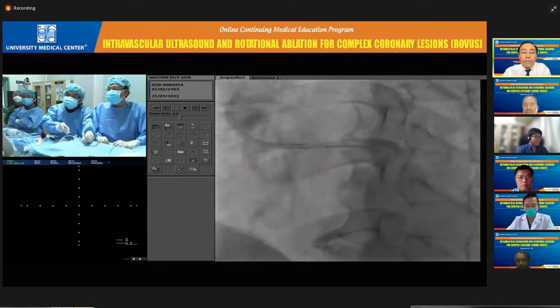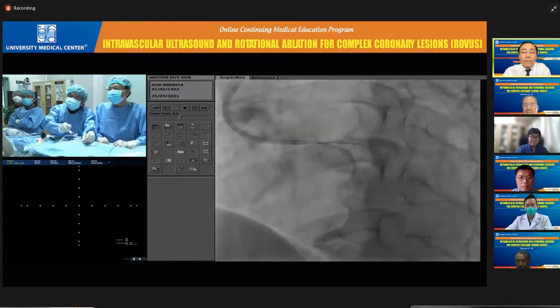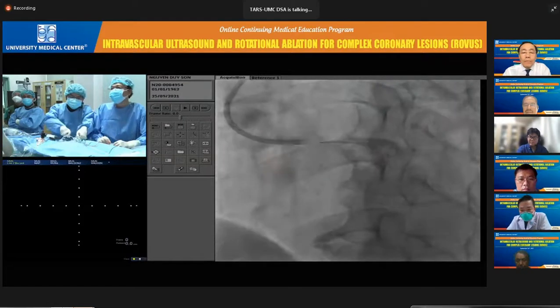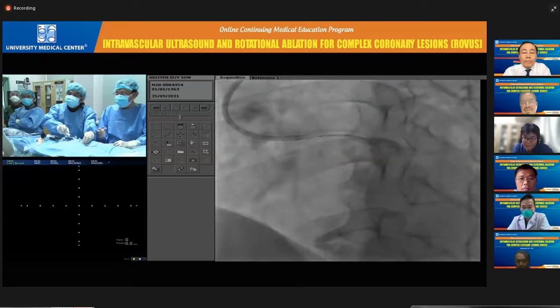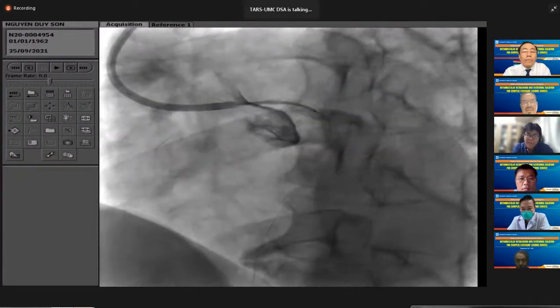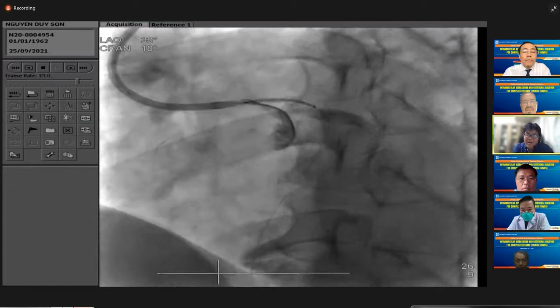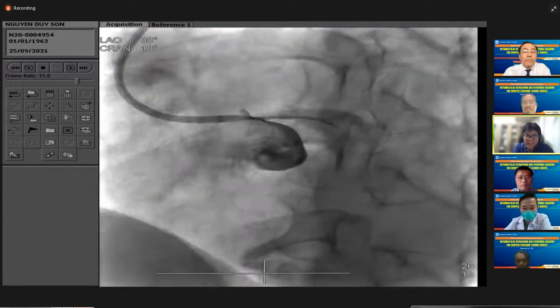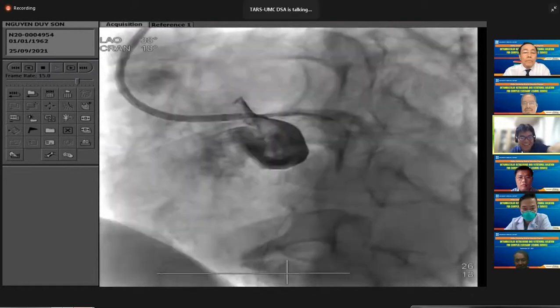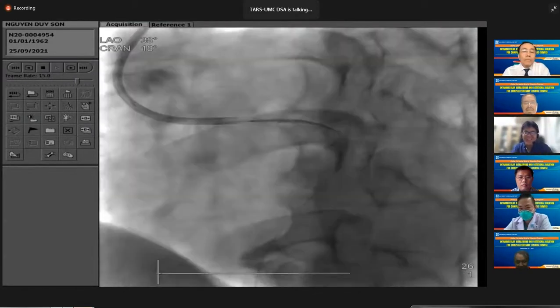Okay, test please. Is it good? Dr. Kuramitsu, more. This is take a picture. The movie does not work very well, but maybe okay. Do you want to push more or pull back?